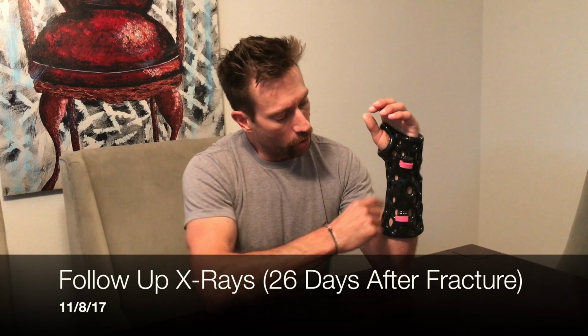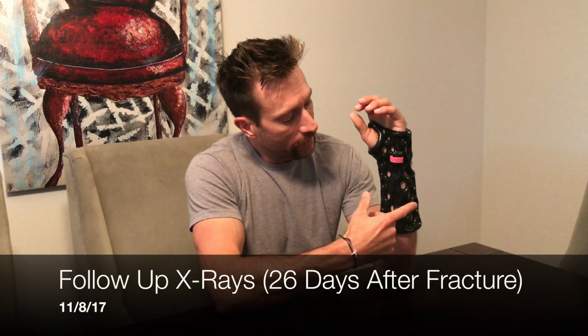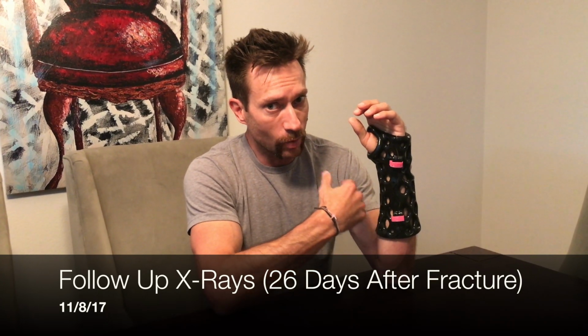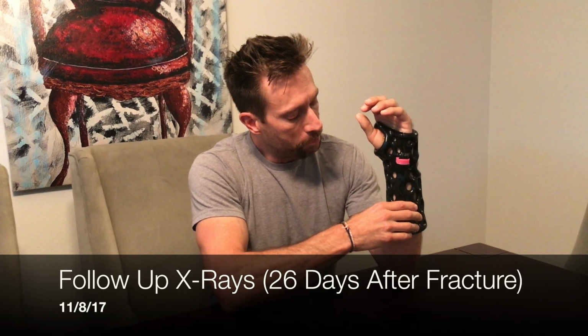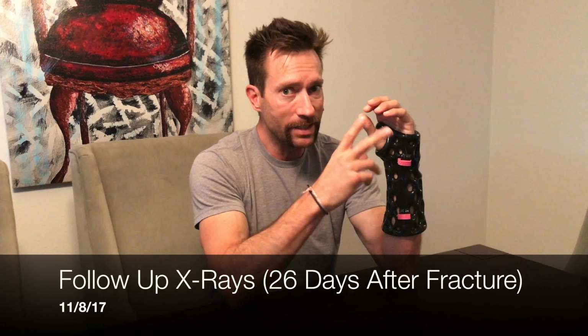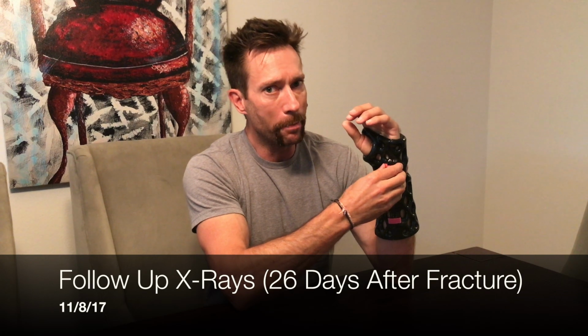Anyway, this is more about the cast. The cast has been great. One of the things that I've talked to Active Armor about, the company that actually manufactures it, as well as Complete PT, the guys that did the measurement, James, is when doing the measurement, you should probably do measurement at least twice to find out the smaller of them, because mine is a little bit big.